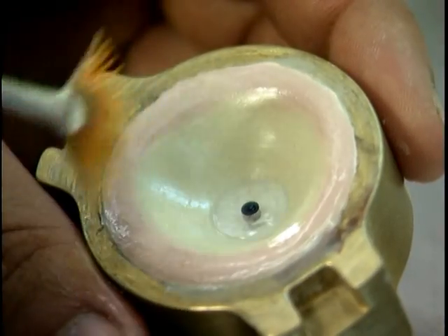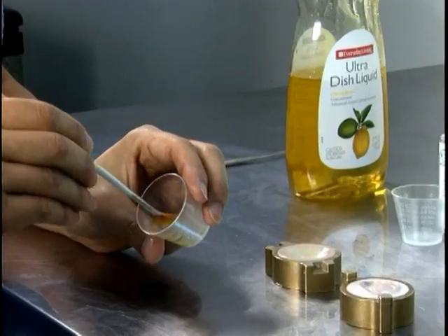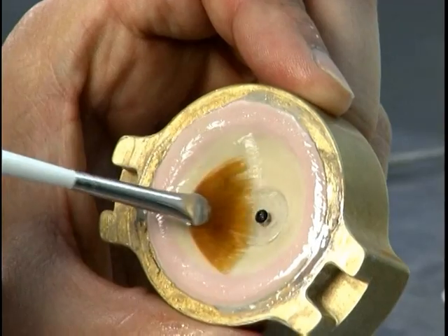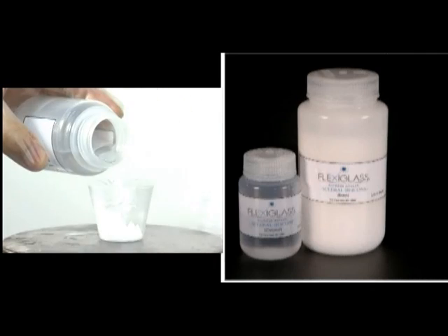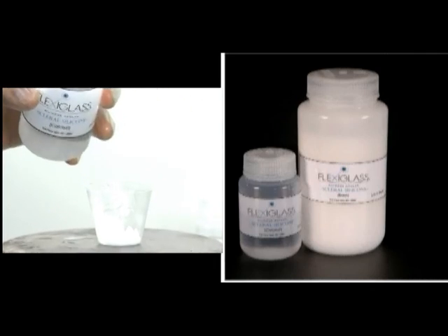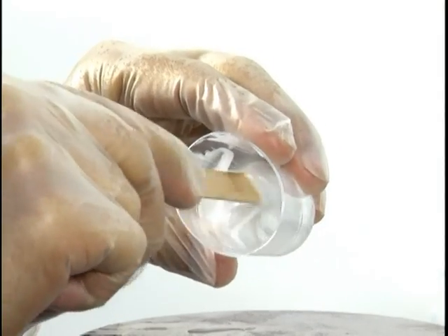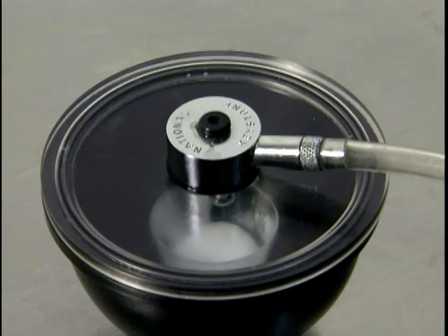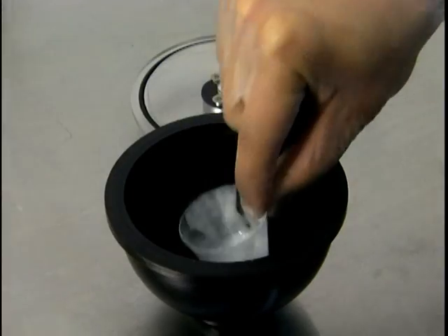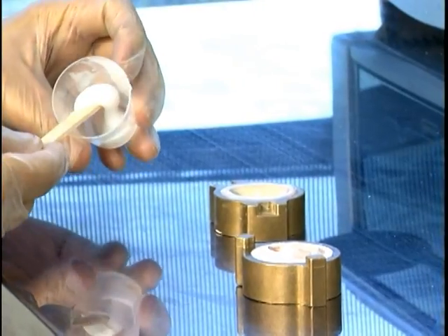Finally, brush on one additional coat of model hardener and release both sides of the mold using dish soap. Pour five grams of scleral silicone base into a DRAM cup and add 10% — half a gram — of scleral silicone catalyst and mix. Place the DRAM cup into an evacuation chamber and evacuate bubbles for three to four minutes. Release air from the chamber and pour scleral silicone into the anterior side of the mold.